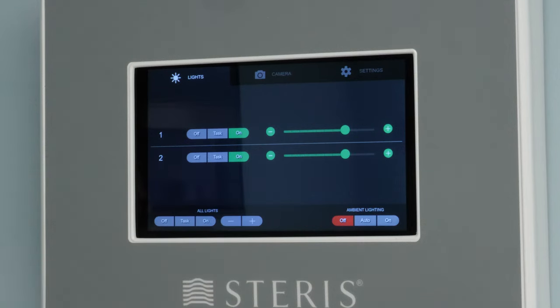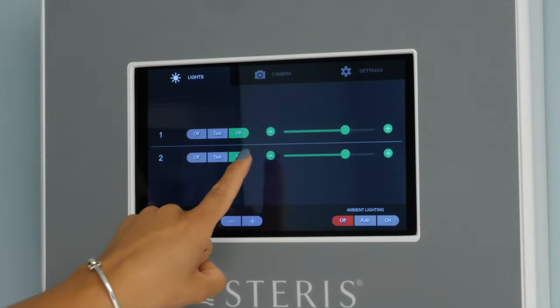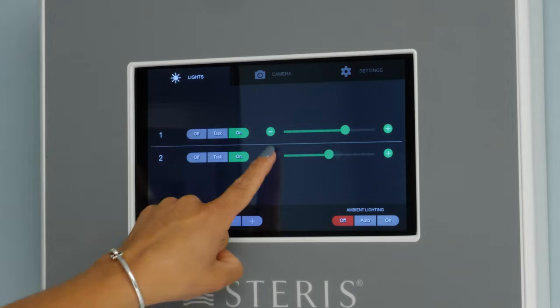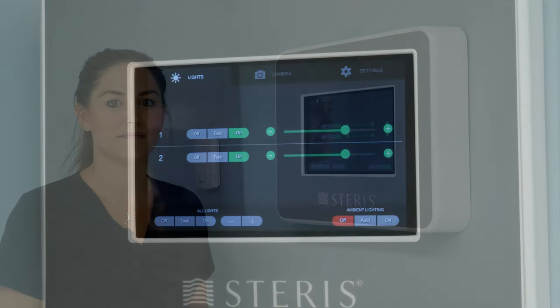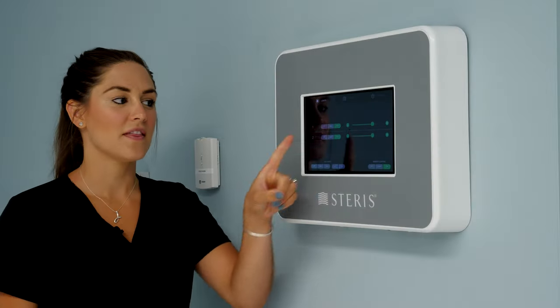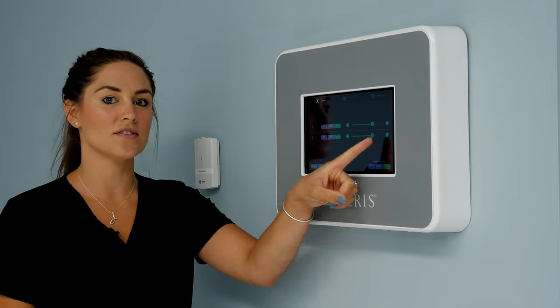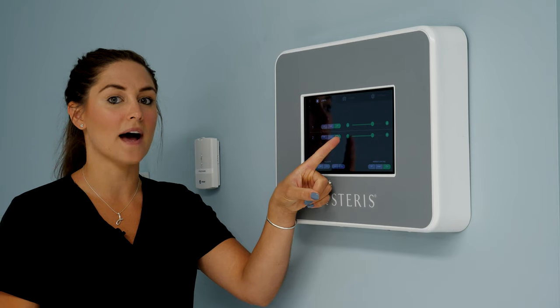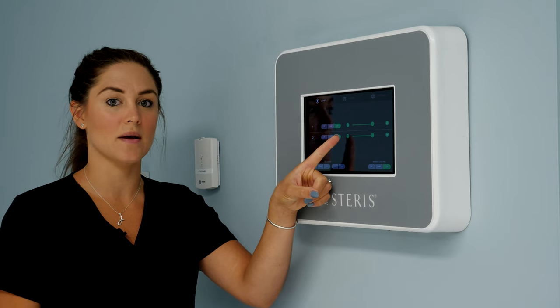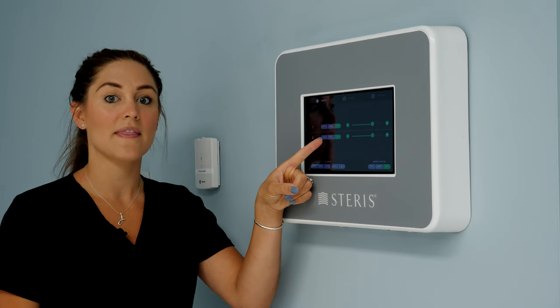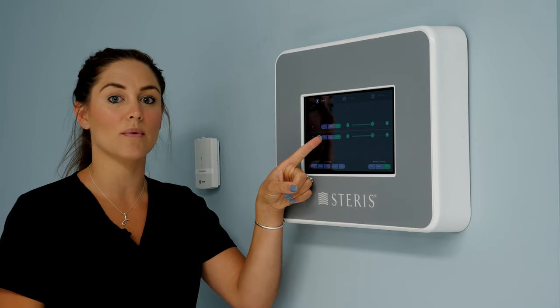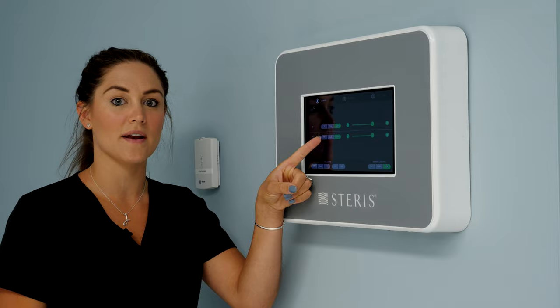You can also hit the negative and the positive to increase and decrease intensity. There are ten different levels of illumination on each light head, plus an additional task mode that we'll cover when we review the light head.